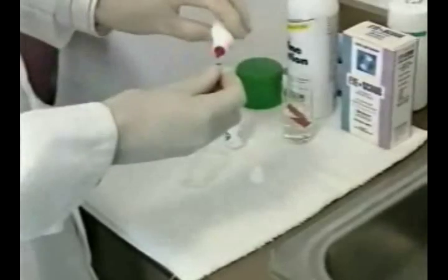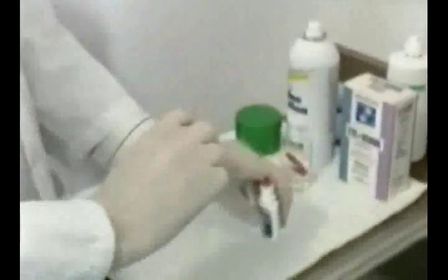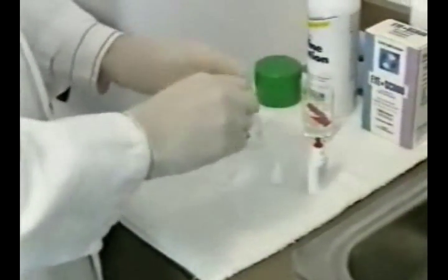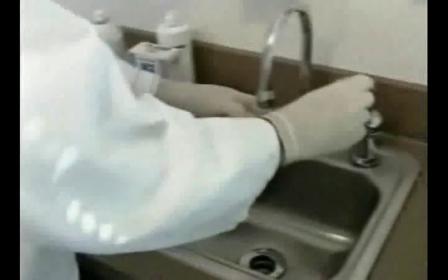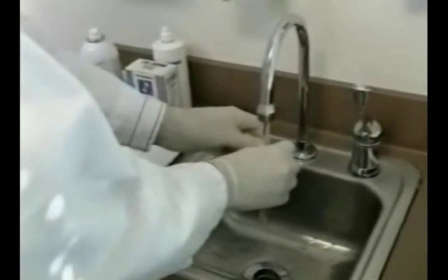Once the artificial eye has been removed, flush your socket using the solution your ocularist recommends. You will then clean the artificial eye. It is important to always use a mild cleaning solution on your artificial eye and never use a harsh chemical such as alcohol. Again, your ocularist will recommend a safe cleaning solution for you. Always rinse the surface of the artificial eye well and apply some form of lubricant before attempting to reinsert the eye.